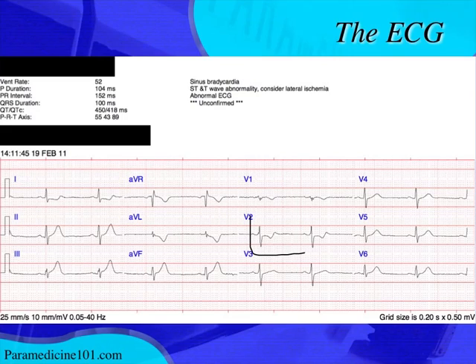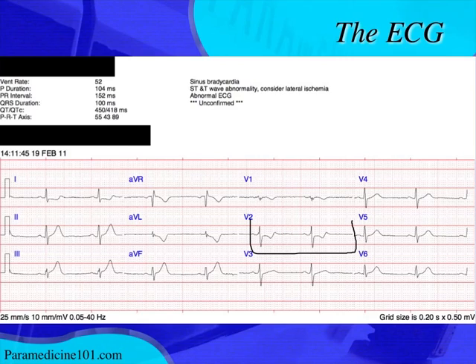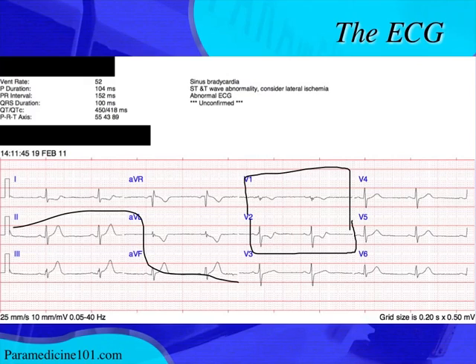What else is on the ECG? V2 looks changed, but it's not a lateral lead and it's certainly not reciprocal to the inferior leads. I want you to imagine the posterior wall being elevated when you see ST depression in V1 and V2, especially in the accompaniment of an inferior wall MI. This change in V2 — and sometimes all the way to V4 — with ST depression and T-wave inversion, the T wave almost biphasic and starting to invert, is indicative of a posterior wall infarct. It's actually a reciprocal change of the posterior wall. It's not always definitively posterior, so you can do a posterior 12-lead to confirm.